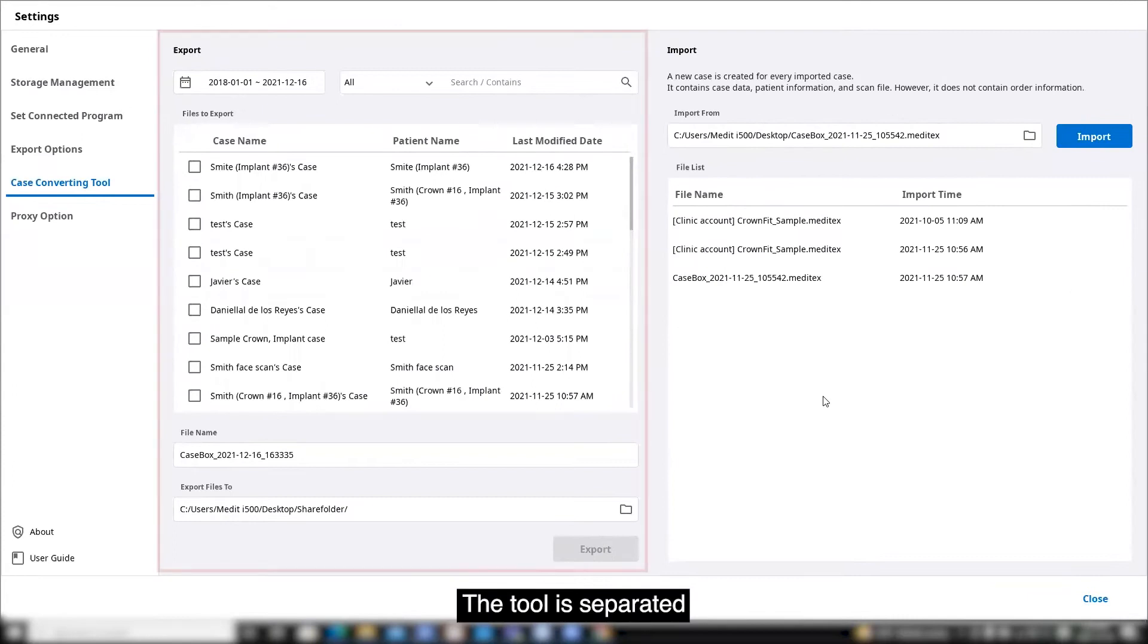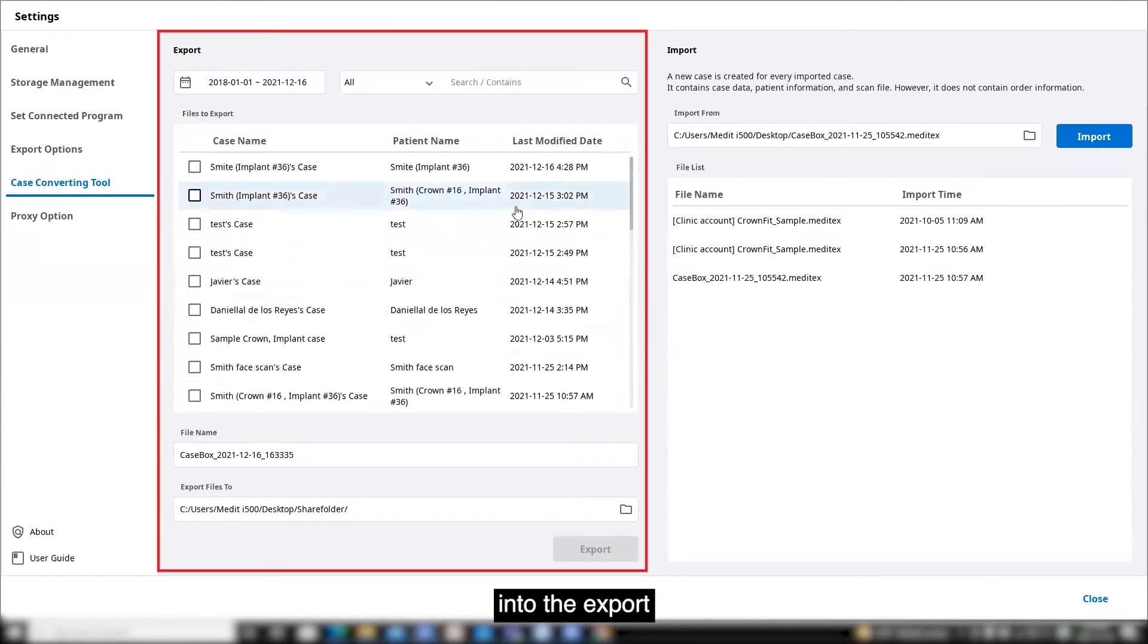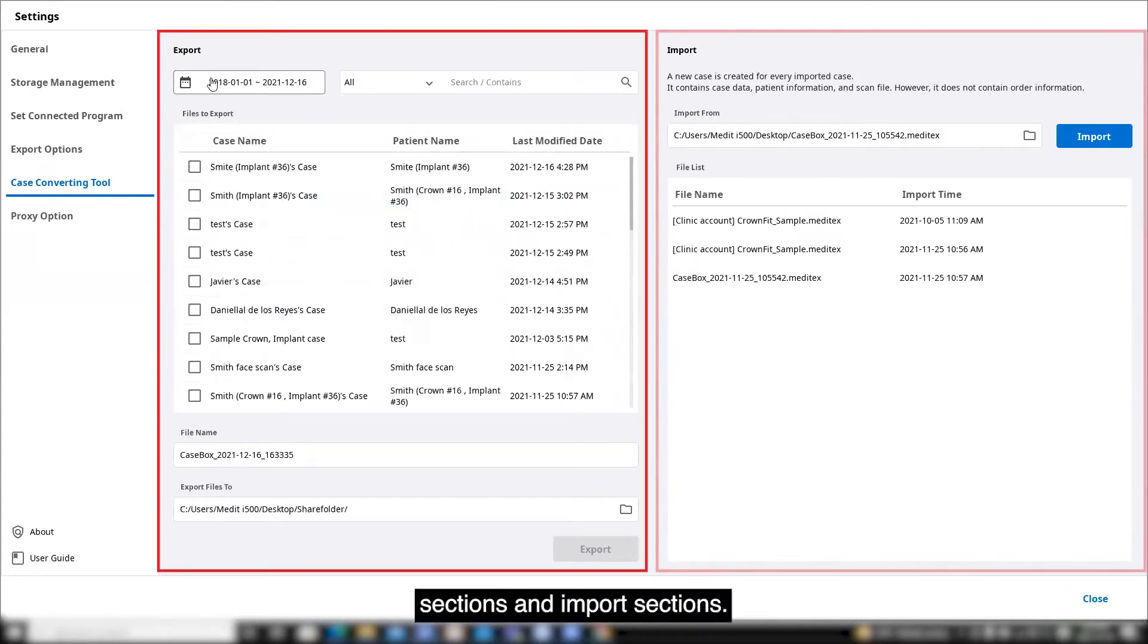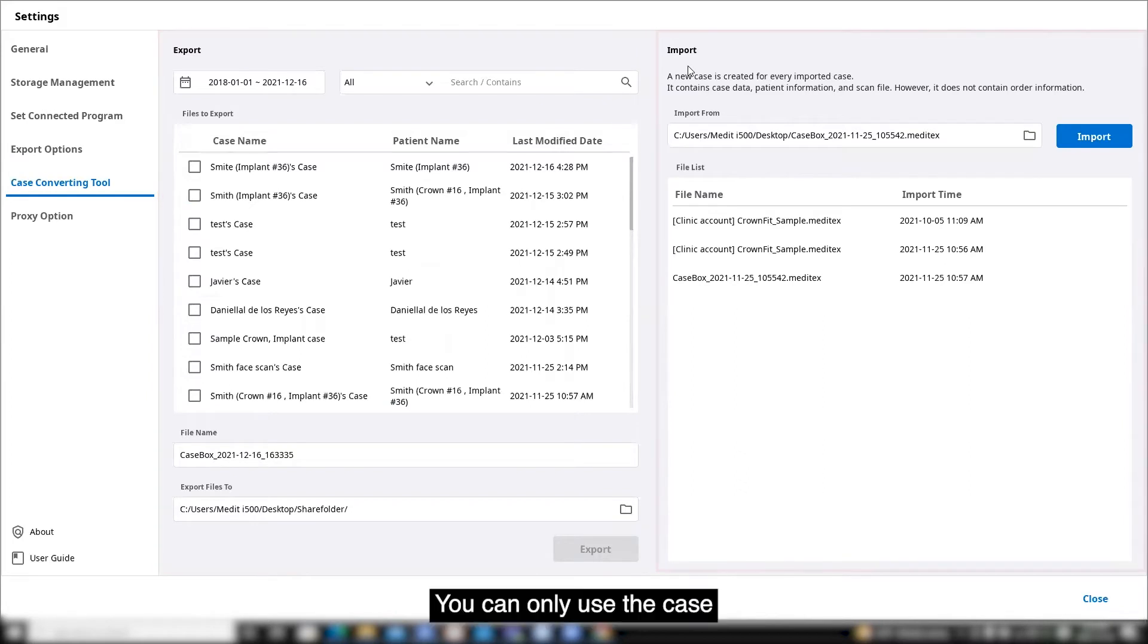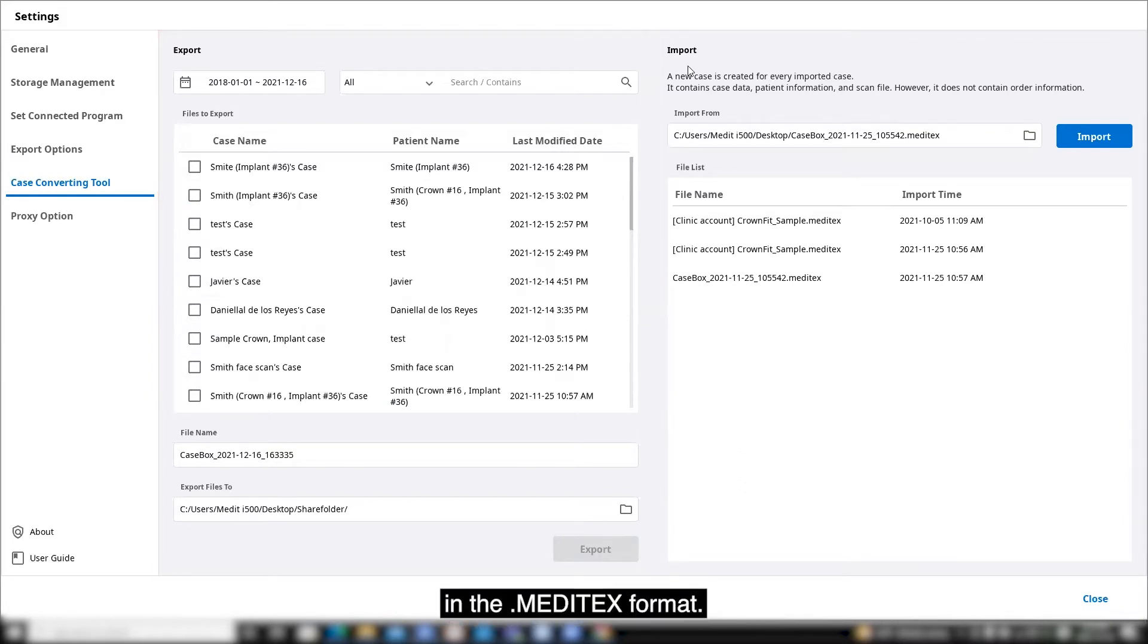The tool is separated into the export sections and import sections. You can only use the case converting tool for files in the MEDITEX format.